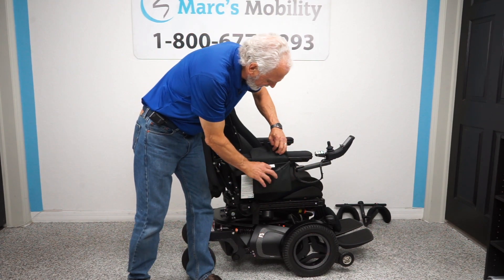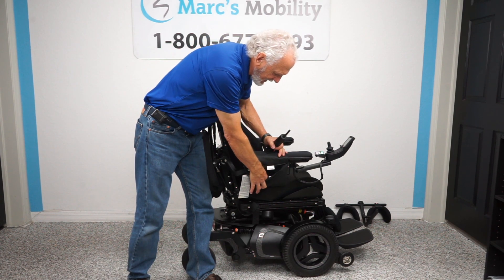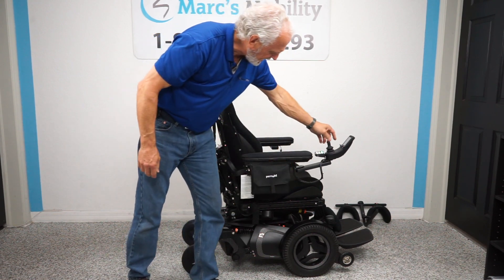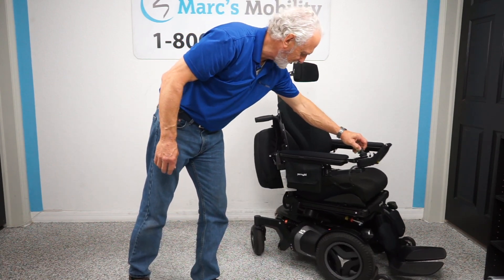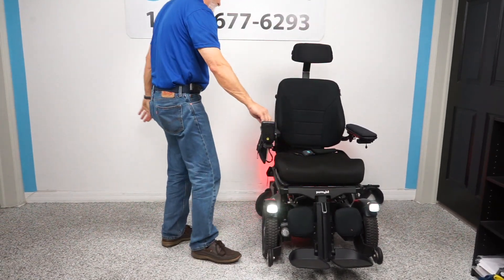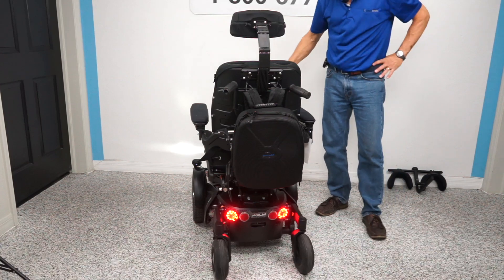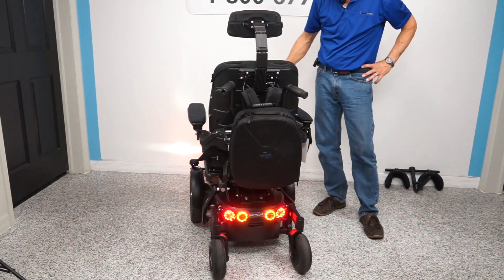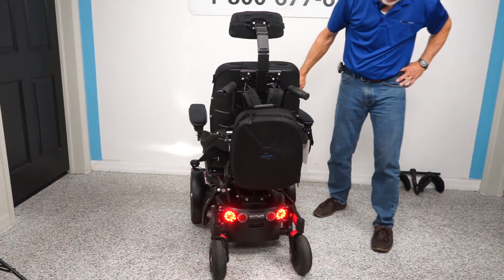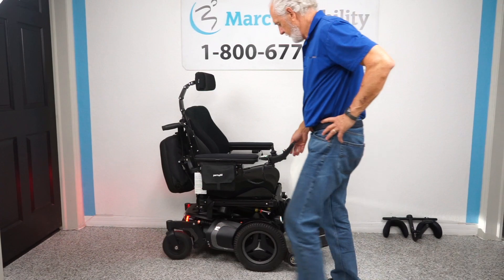There's also a Permobil bag with a pump for the air cushion and small tools — all included with the chair. And from the factory, this chair has headlights, tail lights, a right flasher, and a left flasher — hazards included. You're fully equipped with lighting on this chair.